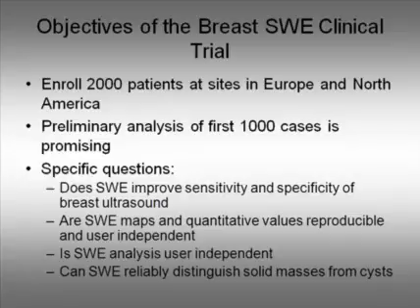of that is. And in order to accomplish this, there has been a multi-center clinical trial which enrolled 2,000 patients at various sites in Europe and North America. The collection of data is still underway, but the preliminary analysis of the first 1,000 cases is very promising.